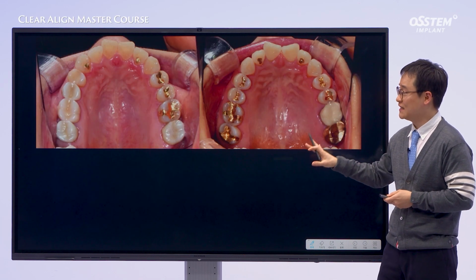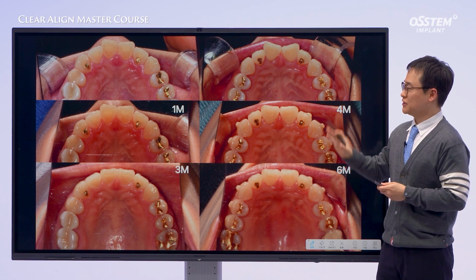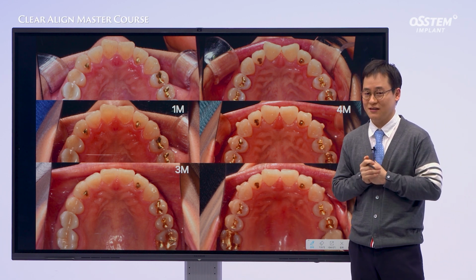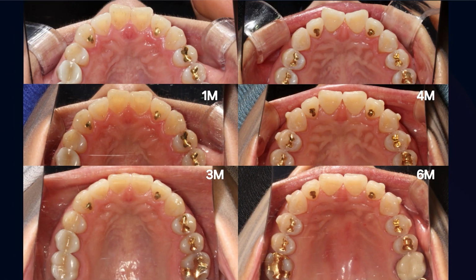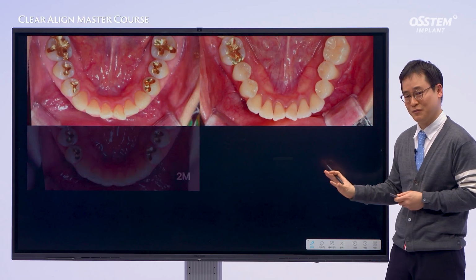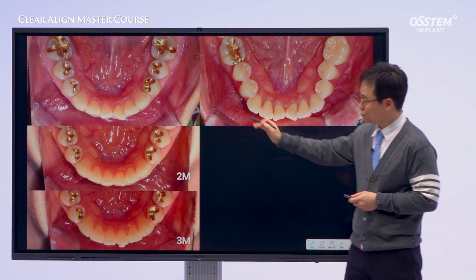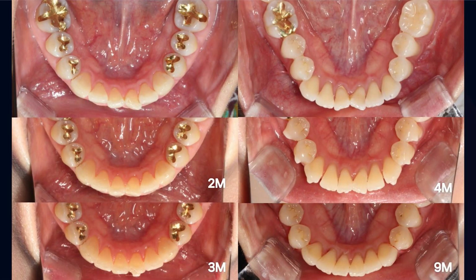Next, when it comes to rotation, most cases are manageable. In the past, rotation was considered a difficult movement to correct. But now, thanks to improved attachment materials, I believe rotation in crowding cases can generally be treated successfully. Various case types exist, including those involving the lower arch. The smaller size of the lower teeth may seem challenging, but treatment generally proceeds smoothly, even if the duration varies.